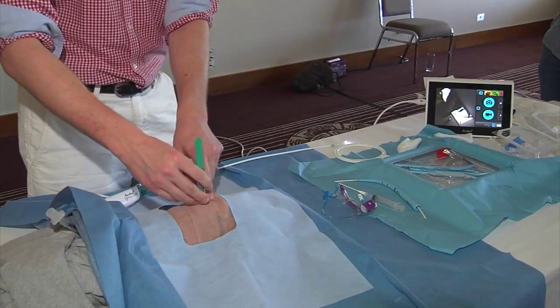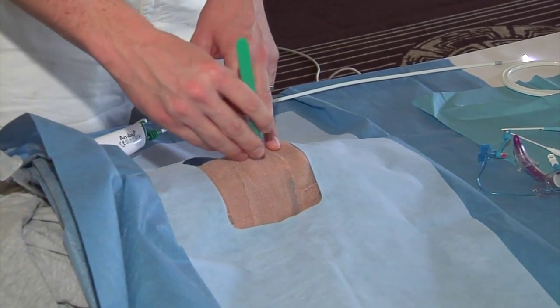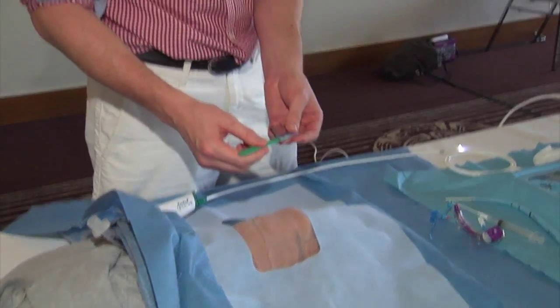I suggest making a vertical incision. Previously I've made horizontal incisions and many people suggest that, but vertical avoids more vascular structures — you can argue the toss for doing either. It's not wrong either way. Make an incision that's about 1.5 centimetres in length.